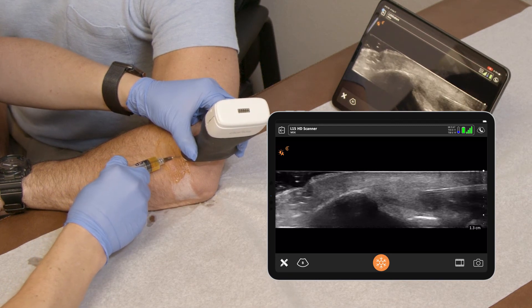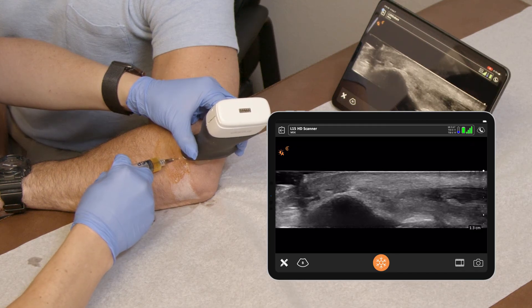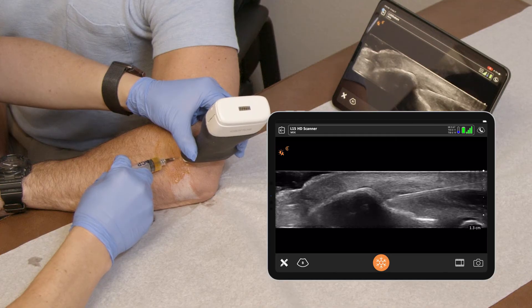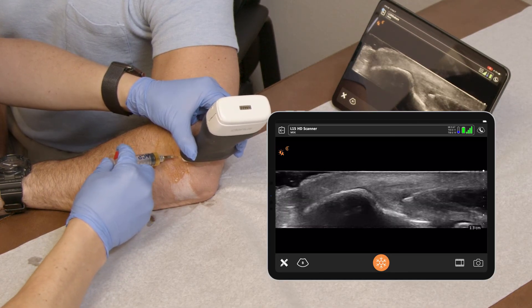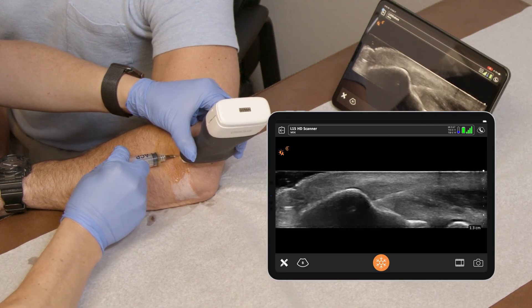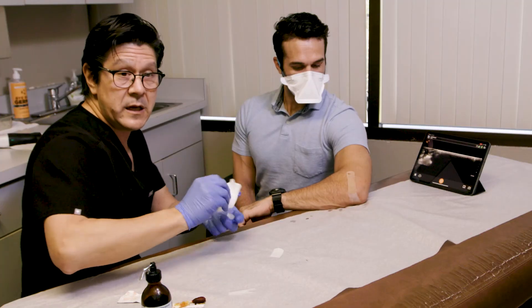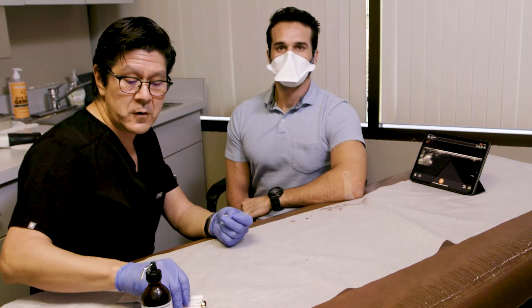How do you feel, Carter? Good. As you can see, I'm spreading it over the whole region to make sure I get it infiltrated to the whole spot. And that's it — we're done. That's an injection to the lateral epicondyle using platelet-rich plasma for lateral epicondylitis.